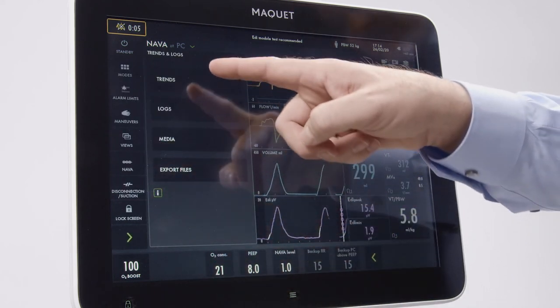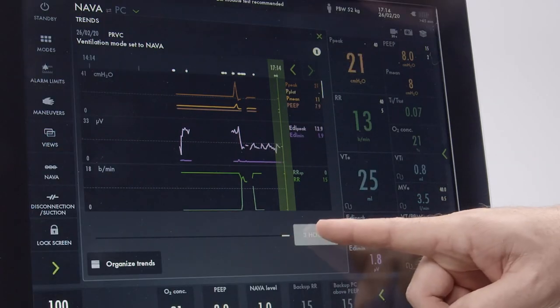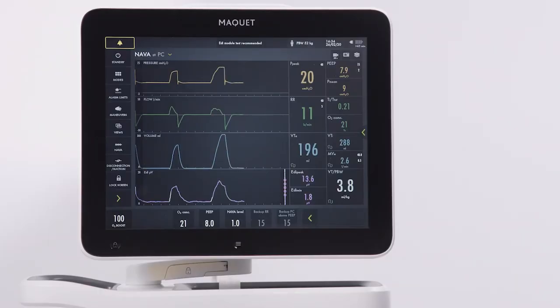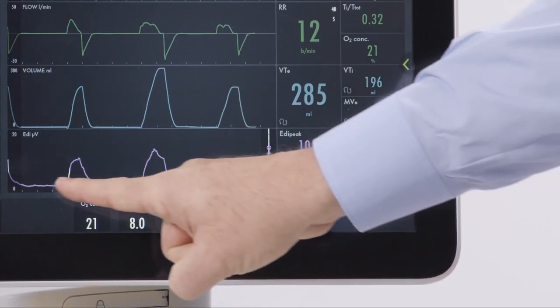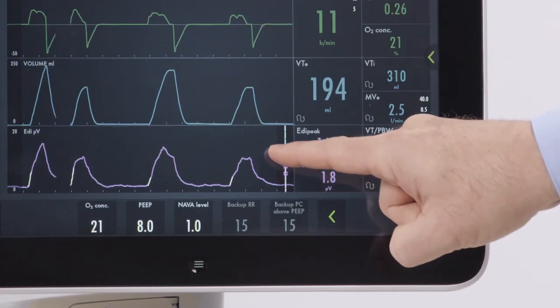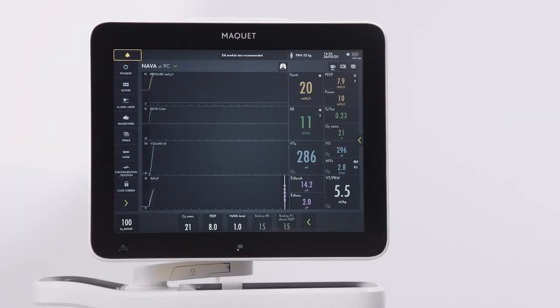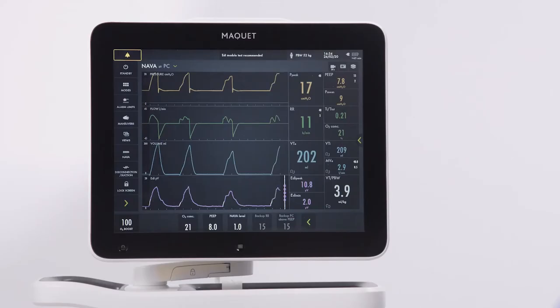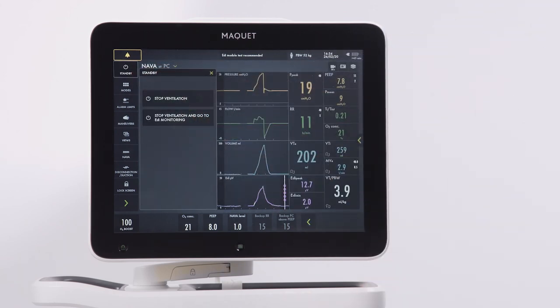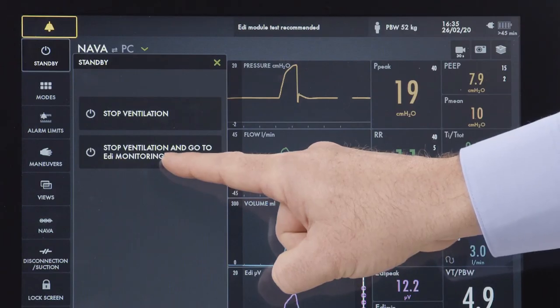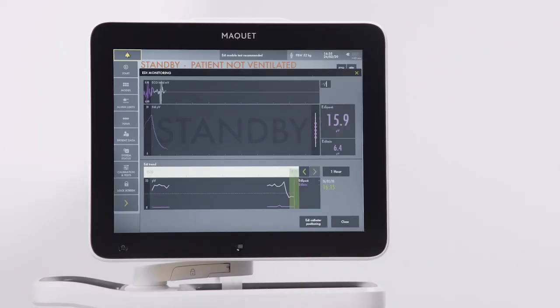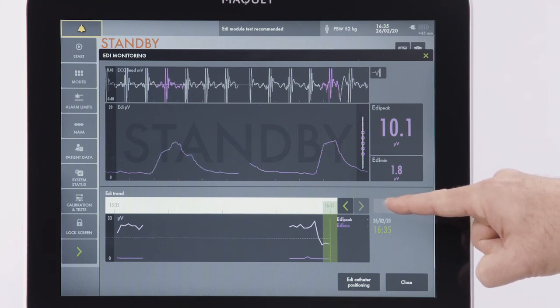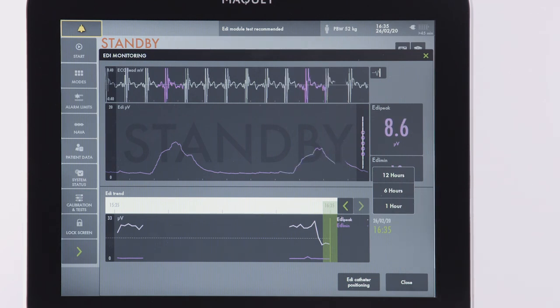The EDI signal is trended and you can see it up to 72 hours in the trends window. On the main screen, you can see the EDI peak and the EDI min both graphically and digitally, and there is a shortcut to see the NAVA positioning window. Press the additional parameters arrow to access the EDI peak and EDI min averages. If you want to stop ventilation and continue to monitor the electrical activity of the diaphragm, this is possible in the EDI signal standby. The EDI signal can be monitored in standby as long as the EDI catheter remains inserted, with up to 12 hours of trends in the EDI monitoring window and up to 72 hours in the trends menu.